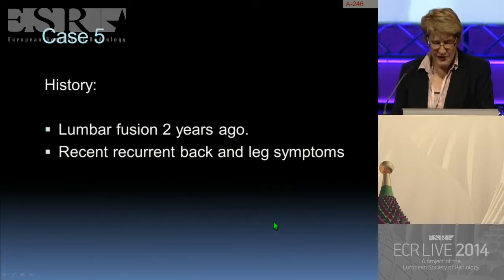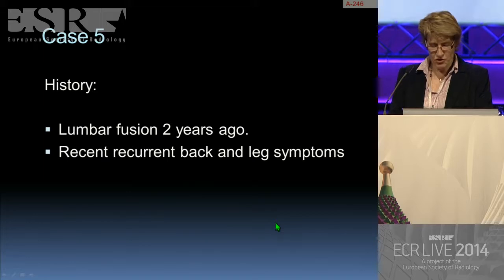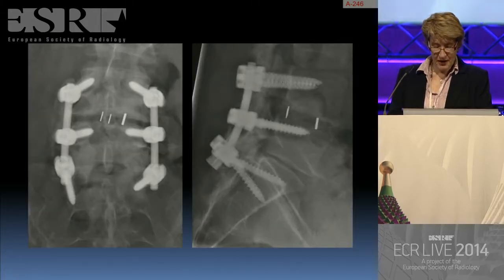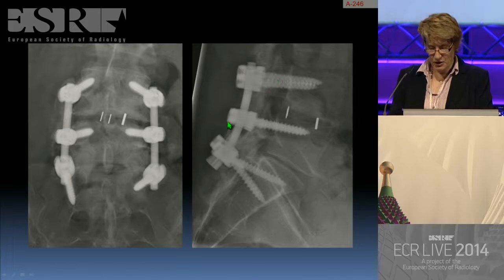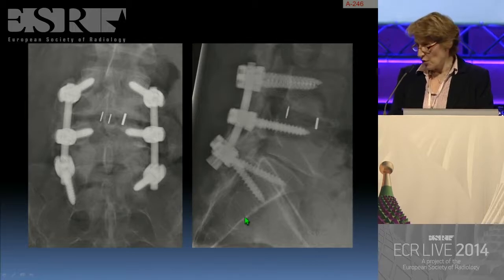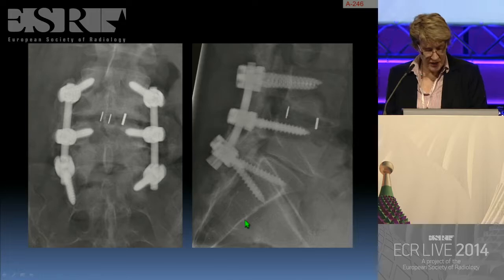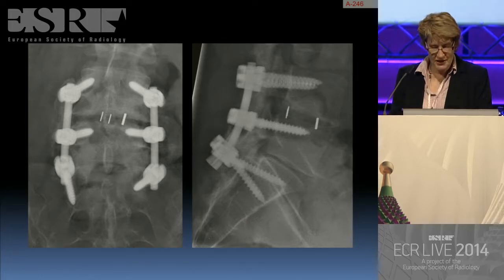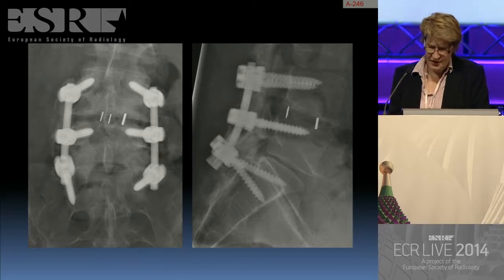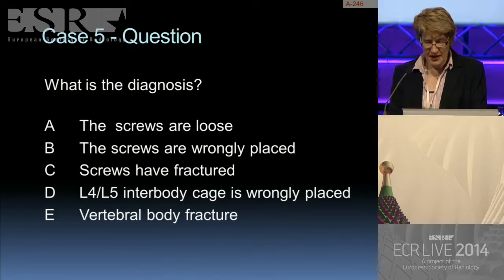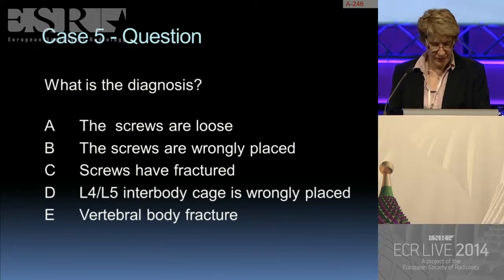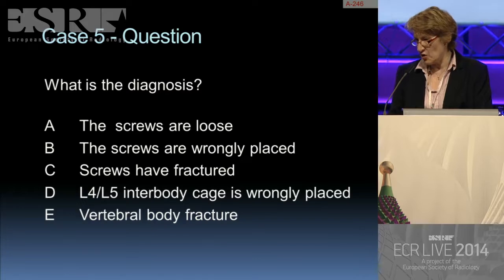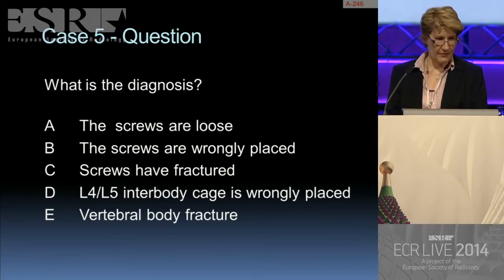Moving on to case five: a patient who underwent a lumbar fusion two years ago and complained of recent recurrent back and leg symptoms. The plain radiographs show pedicle screw fixation and an interbody fusion. This is a case for taking a close look at the metalwork.